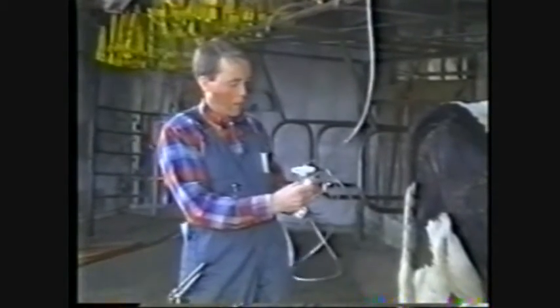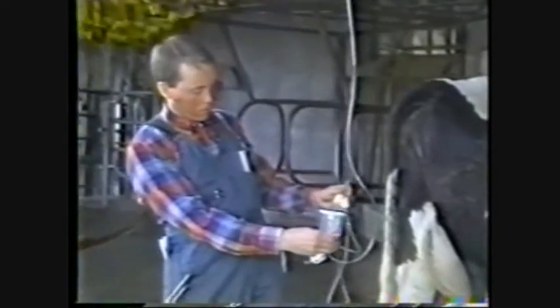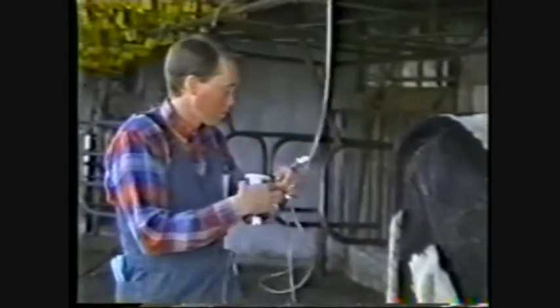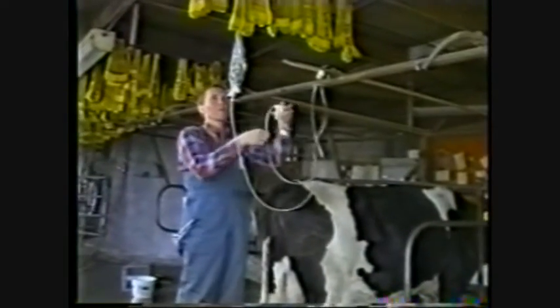Open your clamps. Fluid to come down. That's adequate. That way when the eggs start to first come down the tube, they're not going to drop right onto the mesh screen. Just try and find a secure place to hang this.